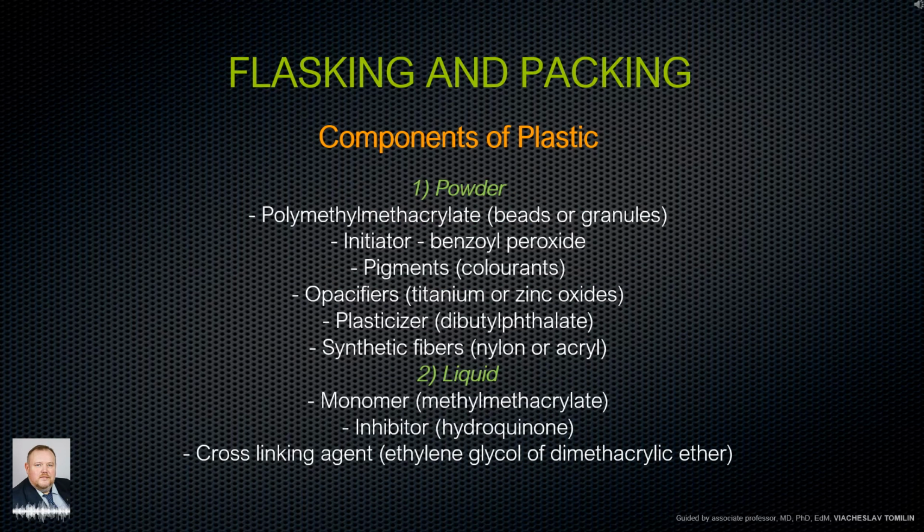3. By the presence of dye: pink, colorless. Components of plastic. 1. Powder: polymethylmethacrylate beads or granules. Initiator, benzoyl peroxide. Pigments, colorants. Opacifiers, titanium or zinc oxides. Plasticizer, dibutylphthalate. Synthetic fibers, nylon or acryl. 2. Liquid: monomer, methylmethacrylate. Inhibitor, hydroquinone. Cross-linking agent, ethylene glycol dimethacrylic ether.